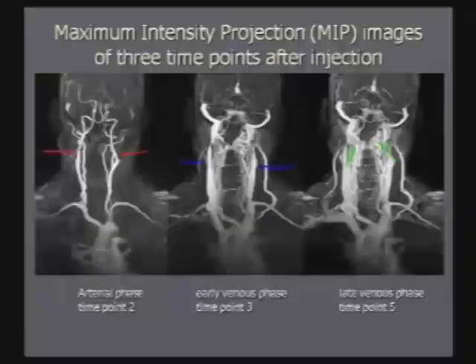Clearly, if you're an interventional person doing this work, you want to start at the valves first and see, is there a problem? And then you may find, after you've treated those valves, that what we were seeing in MR is gone. And in fact, if I re-image somebody and look at this again, I may find they're gone too. So Sal, although I wouldn't want to necessarily operate in that area, I would say that it's a good marker that there's something abnormal there. And so this is, I think, useful information for the interventionalist.